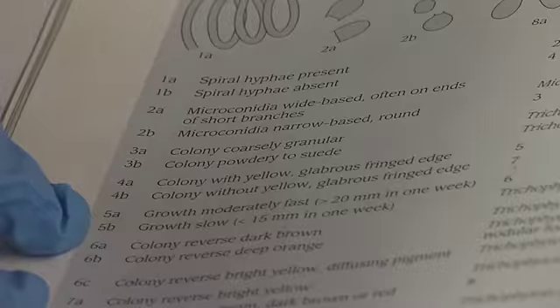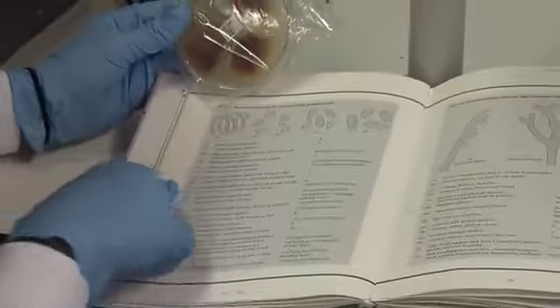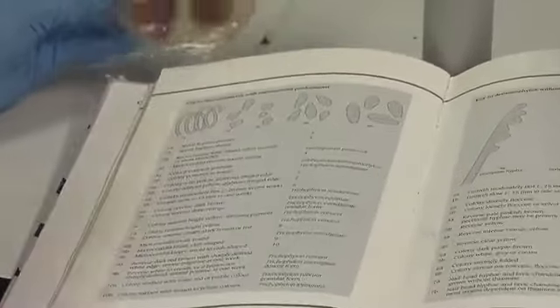Trichophyton species are usually characterized by the presence of many microconidia, round or elliptical, with few thin-walled, smooth macroconidia. Microsporum species are usually characterized by the presence of many spindle-shaped macroconidia, which are often rough-walled and multi-celled, with few microconidia. Epidermophyton floccosum is characterized by the presence of small, clavate, club-shaped, smooth-walled macroconidia, with between 2 and 4 cells, and no microconidia.